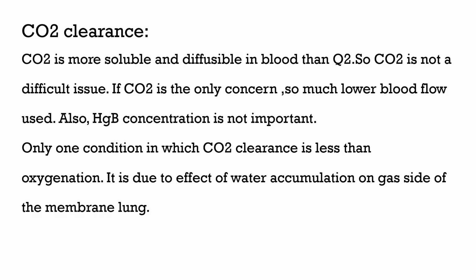Regarding CO2 clearance, CO2 is more soluble and diffusible in the blood than oxygen. So CO2 clearance is not a difficult issue. CO2 is the only concern, so a much lower blood flow is used. Also, hemoglobin is not an important issue in CO2 clearance.